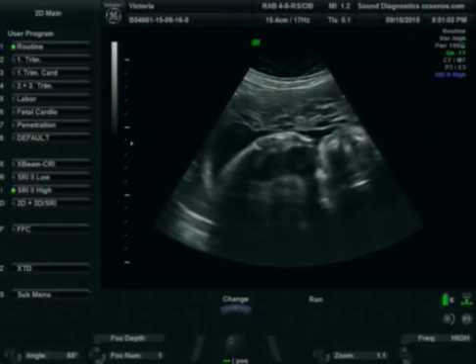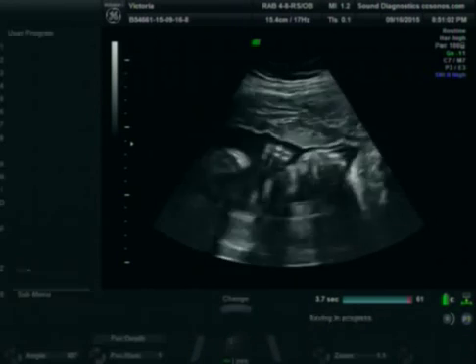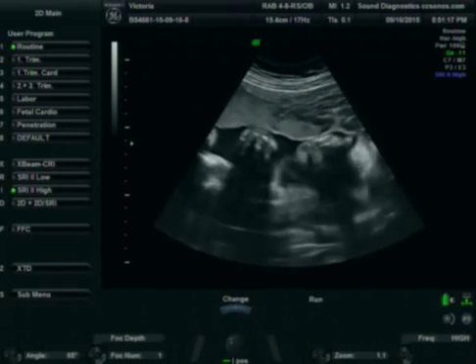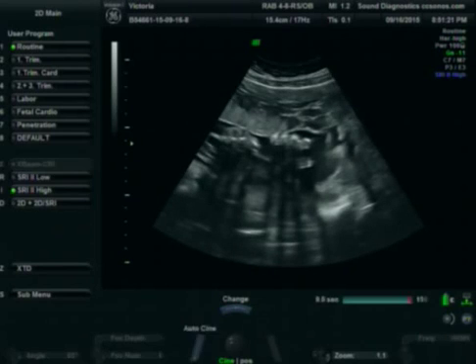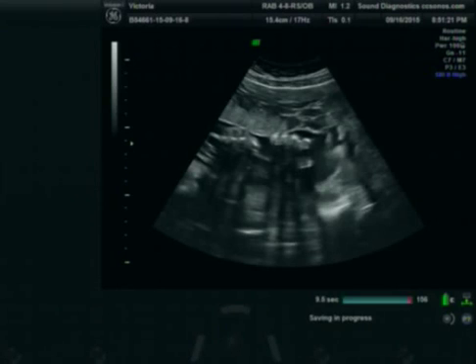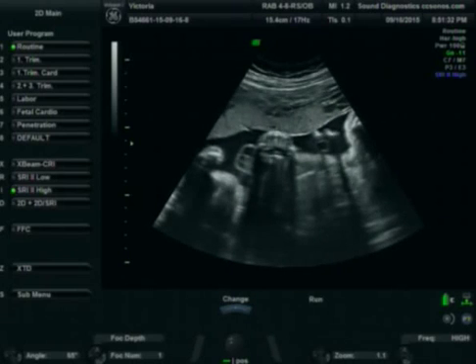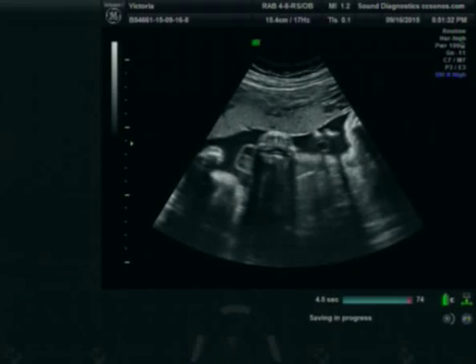You should have told your husband he could have waited for food. There's an arm, shoulder, elbow, wrist, and hand coming up right by the face there. Maybe it's a drama pose. Already like her mom. No, she's giving the finger. The fingers are straight across there. 1, 2, 3, 4, the side makes 5 for that one. She's like, yeah, that's our baby. And a little hand there, knuckles straight across. 1, 2, 3, 4, thumb on the side makes 5.